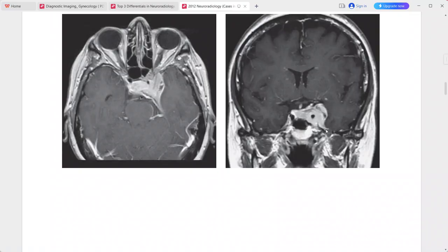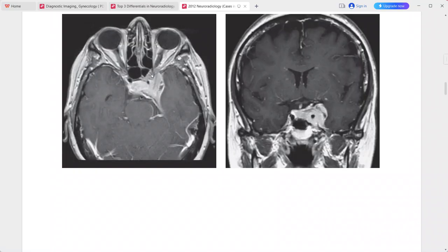There is an enhancing dural tail along the petrous apex, and the mass extends into the left orbital apex, exerting mass effect on the optic nerve. This is a case of cavernous sinus meningioma.